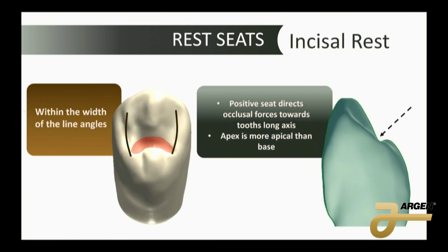And then a cingulum rest, very similar. Most importantly, you have to have a positive force. It is a lot. There are some more in-depth things with this, but if you're just trying to get the basics across and you're trying to just have a basic conversation with your dentist, these are some of the key points that you want to hit.